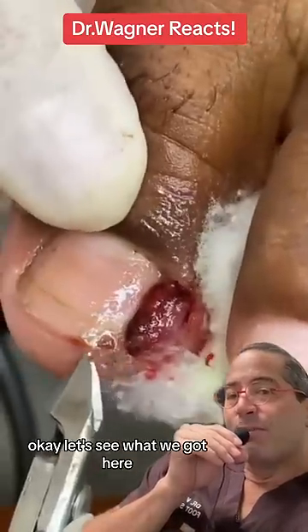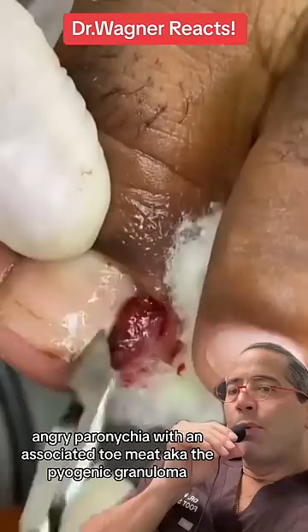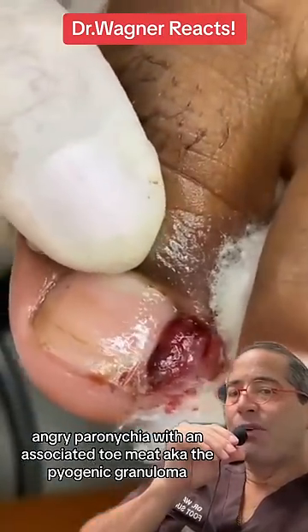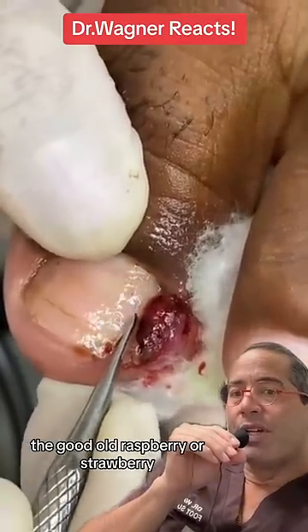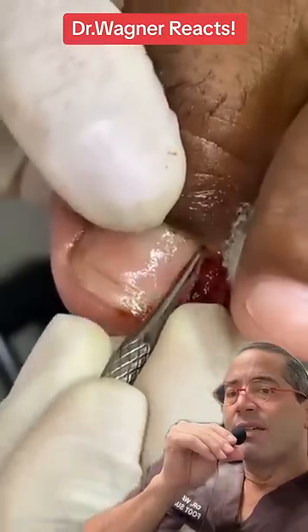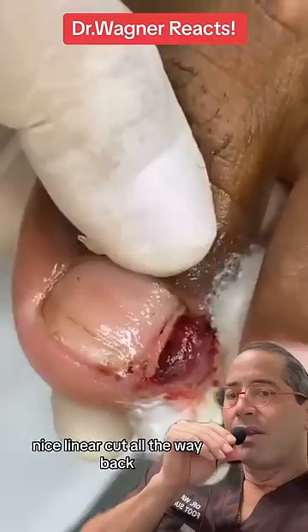Okay, let's see what we got here — angry paronychia with an associated toe meat, aka the pyogenic granuloma, the good old raspberry or strawberry. This clinician is using a very nifty blade, making a nice linear cut all the way back.